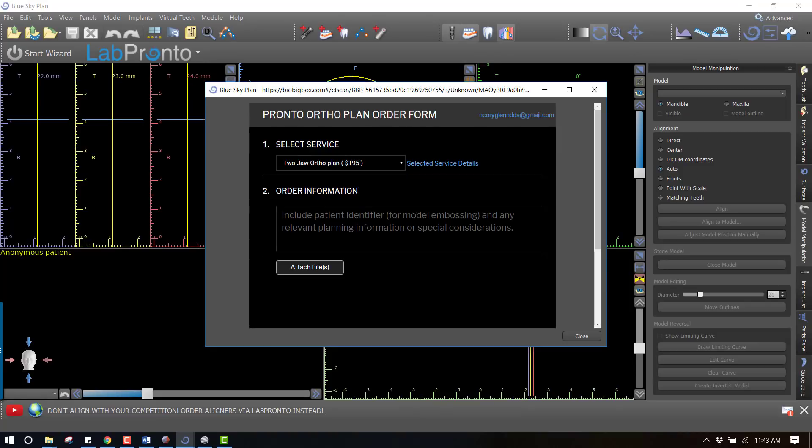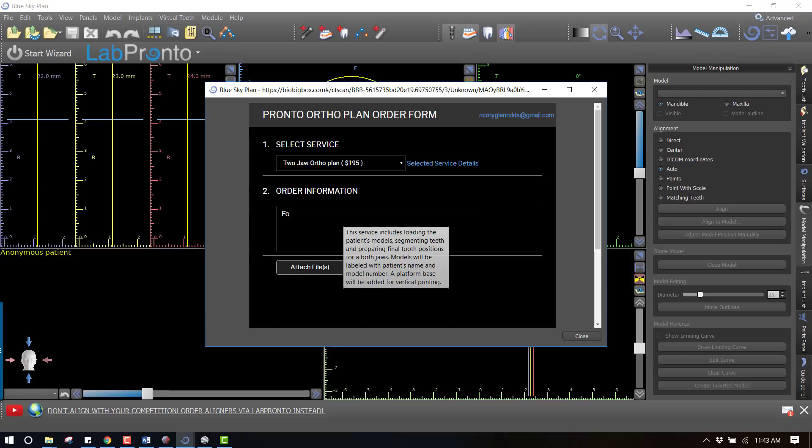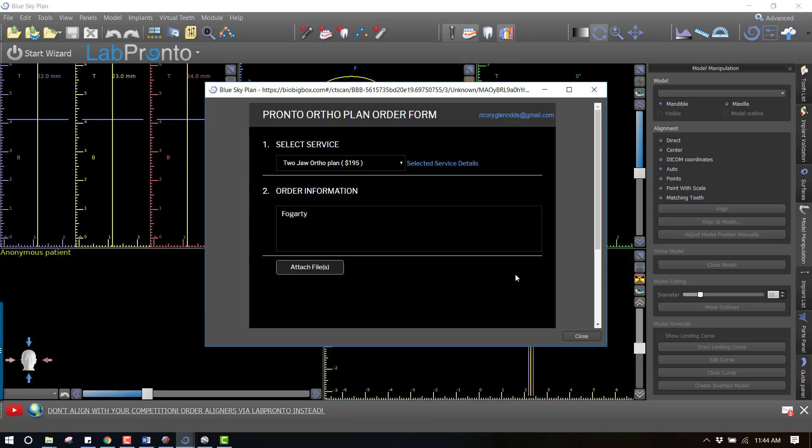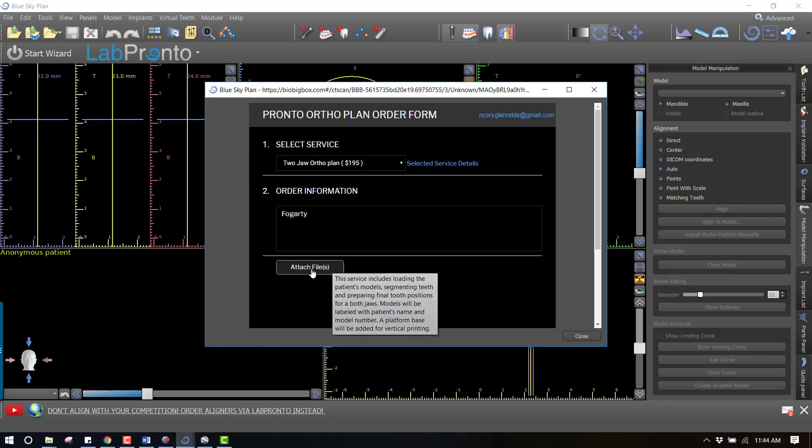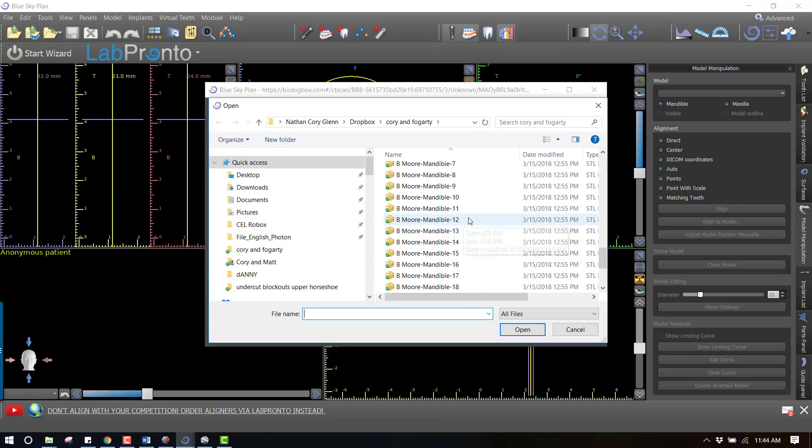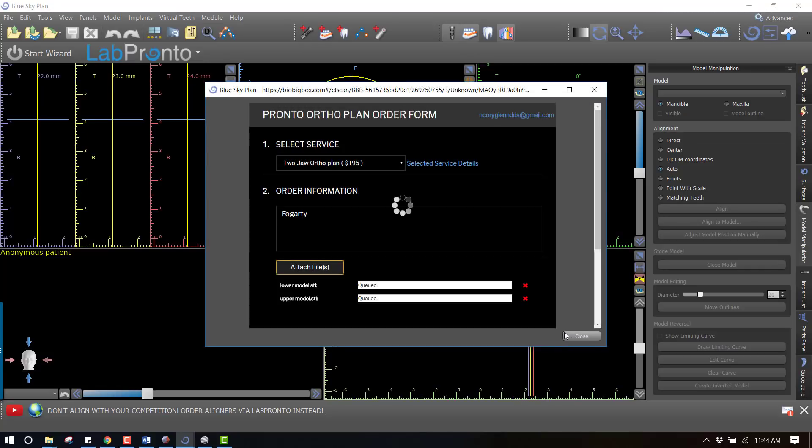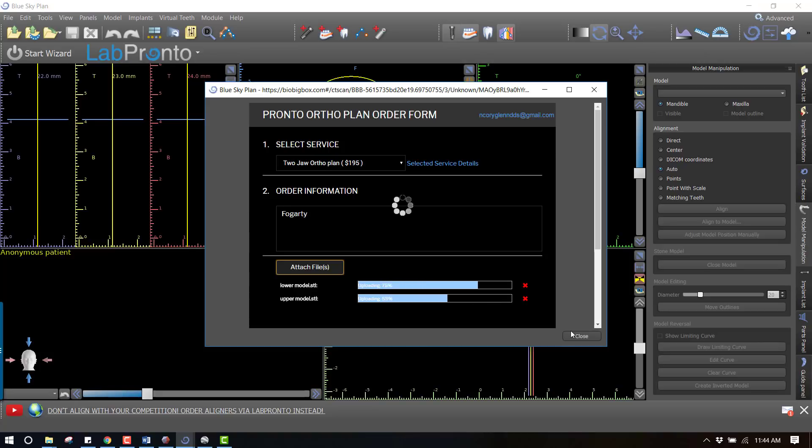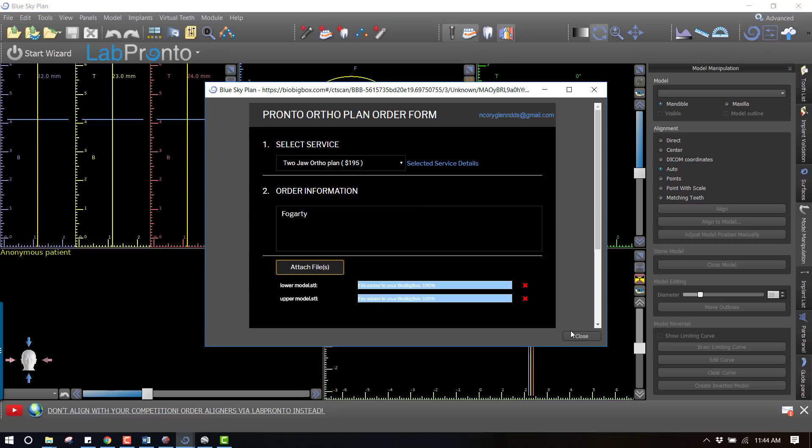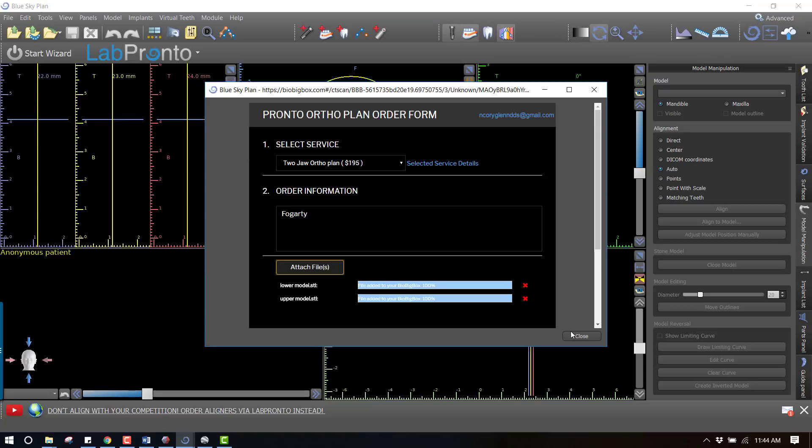We can put in any kind of patient identifying information - this is my orthodontist buddy so we'll just put his name in because I'm helping him out with this case. Then we need to attach the files, so we can go down and find the lower model and the upper model, control select and open, and now these upload into the Lab Pronto portal. As this is uploading into the cloud, I should say this is using our Bio Big Box service which is a HIPAA compliant cloud storage. You can get a free account that will hold a couple of gigs I believe, and then you can certainly pay for additional storage beyond that.